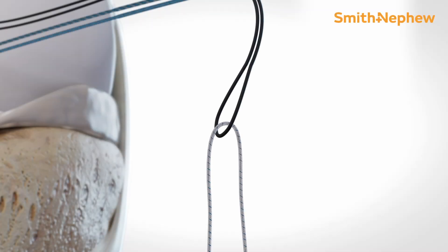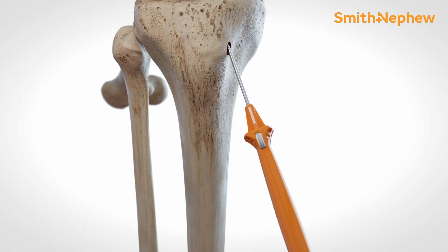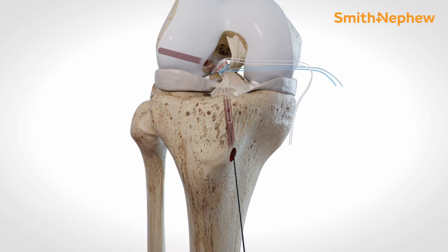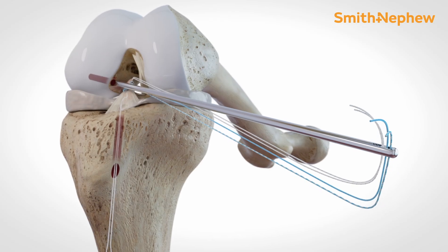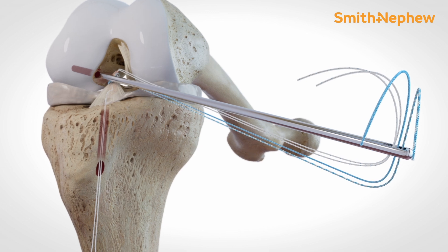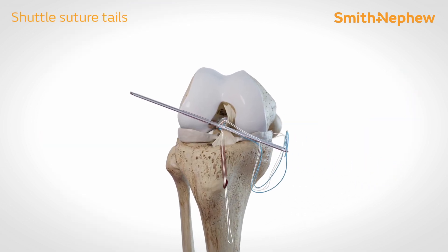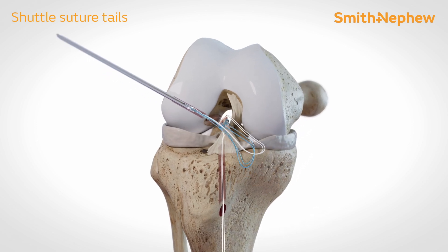Load a number 2 ultra-braid onto the monofilament and pull the acupass suture shuttle back down the tibial tunnel. Outside the joint, thread all the suture tails through the eyelet of the 2.4 mm guide wire and shuttle them out of the femoral cortex.